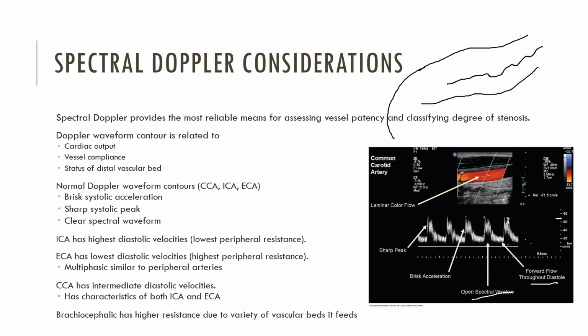And then pretty soon you drop down a waterfall. Now you're going really, really fast. Well, you had indicators previous to that waterfall that were like, hey, heads up, something's coming. When you get to the end of that waterfall and you reach the bottom of it and you hit water, all of a sudden you get a lot of turbulence here.